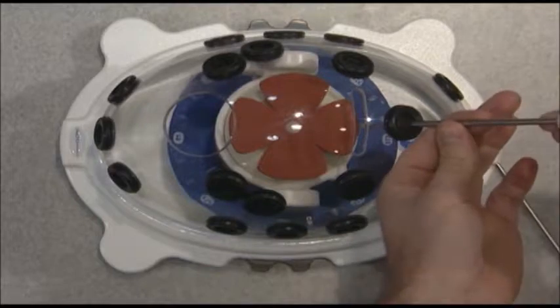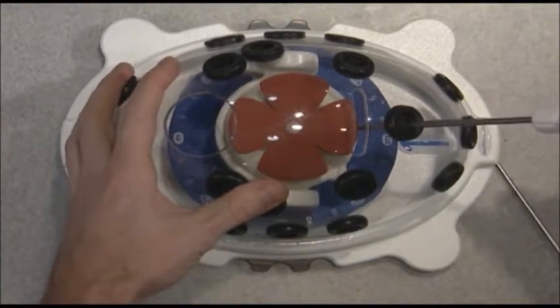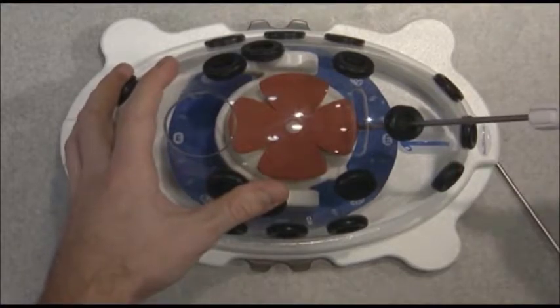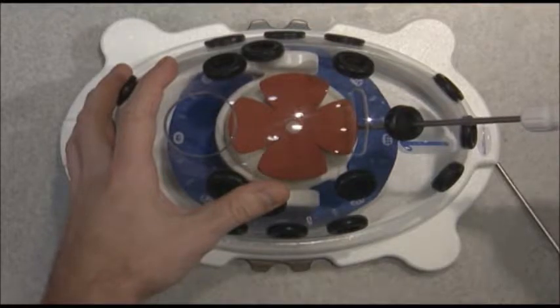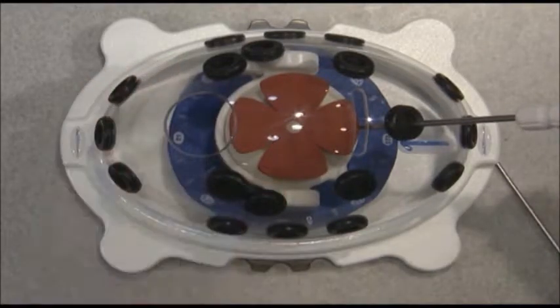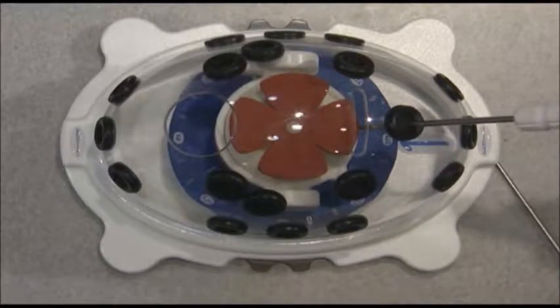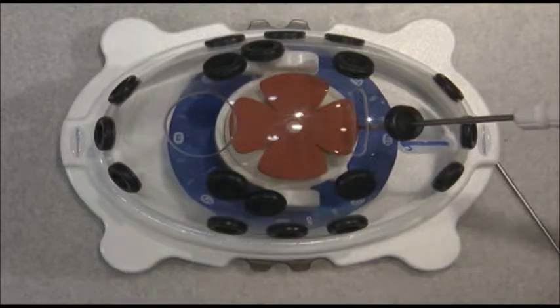This is our anchor now, and I'm going to place the anchor into that same hole and then twist the anchor in. And with this particular anchor, we want that line lined up with the rotator cuff to allow for optimal passage and slippage of the suture. And we want the anchor to be seated approximately a millimeter or 2 below the cortical surface of the bone.